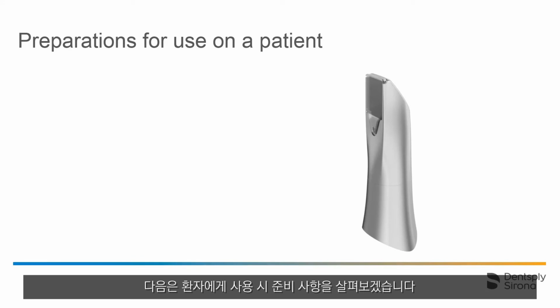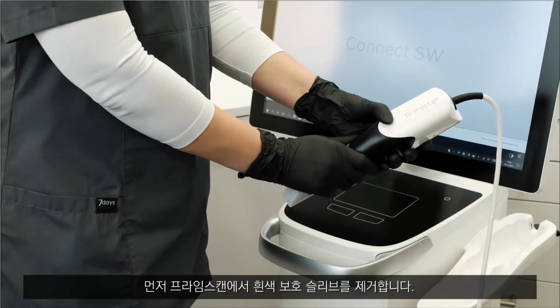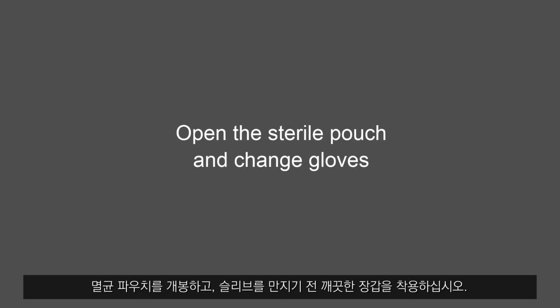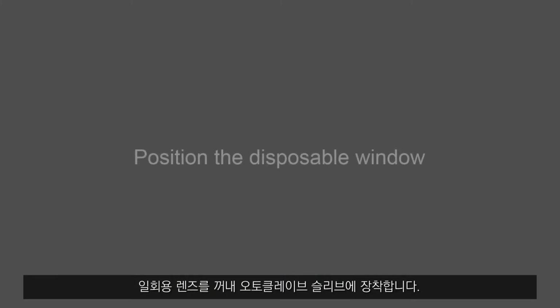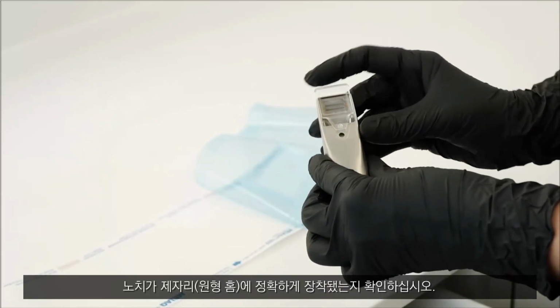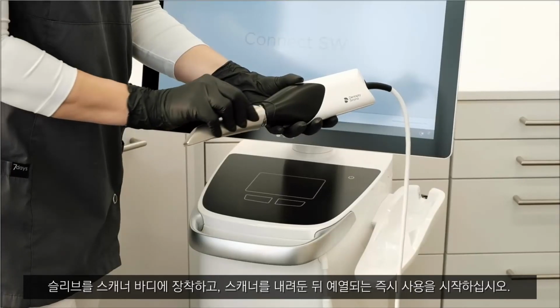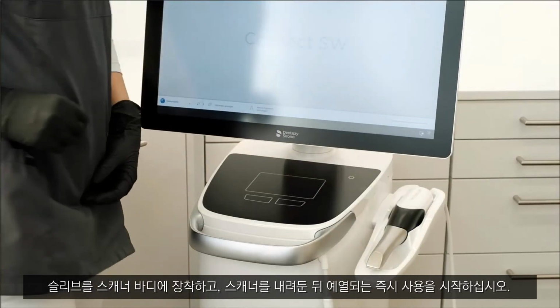Now let's look at the preparations for use on the patient. Start by removing the white protective sleeve from the Primescan. Open the sterile pouch of the sleeve and put on clean gloves. Retrieve one window and place it inside the sleeve. Make sure the small notch fully snaps into place. Attach the sleeve, position the scanner in the cradle, and start using as soon as it's warmed up.